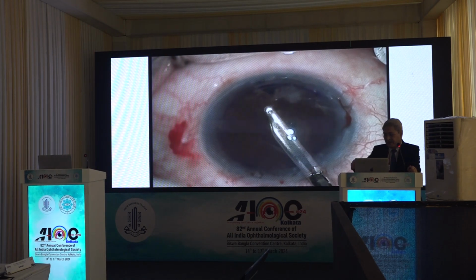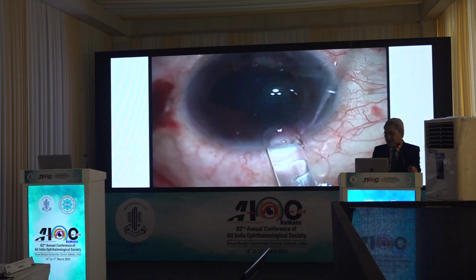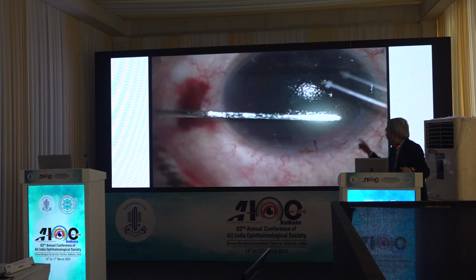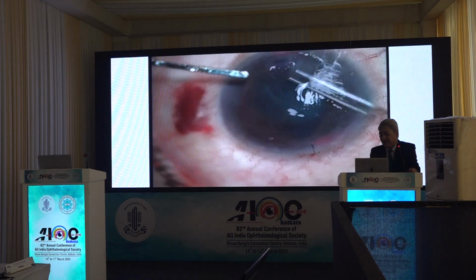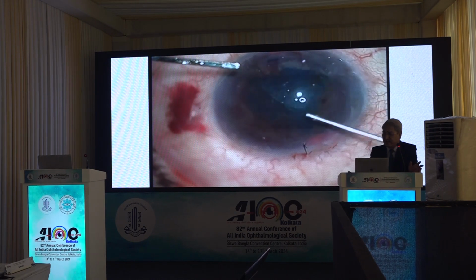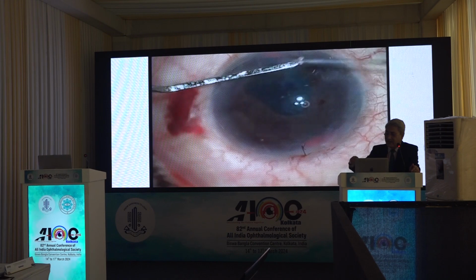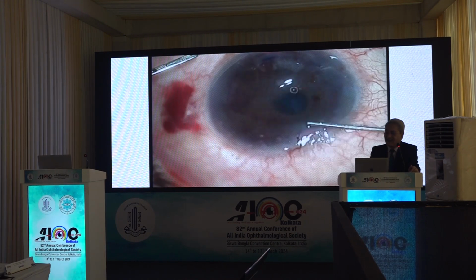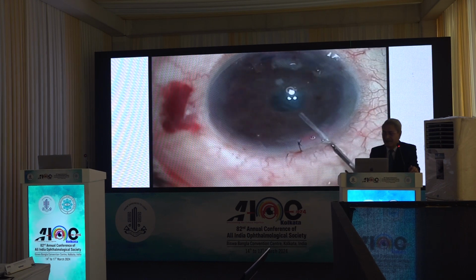During PI, I realized that the IOP is so low. While going in, I was tapping, and at that time I didn't have much experience. You see that I was tapping and it was going inside the pupil. I didn't realize that it went inside the pupil, so it is definitely behind the iris.